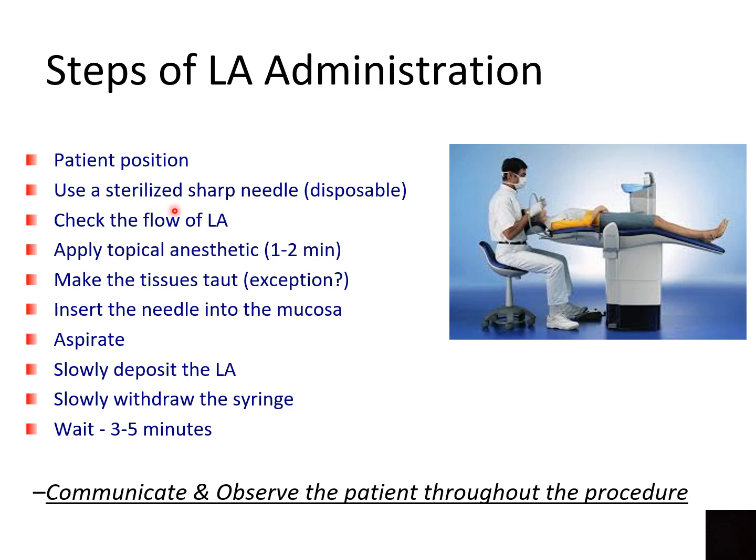So whilst you may be able to use the same needle for repeat injections on the same patient, should you be treating a patient with an acute infection like a dental abscess, it's best not to reinsert the needle if it has been used close to the site of an abscess. So you may want to use a new needle.